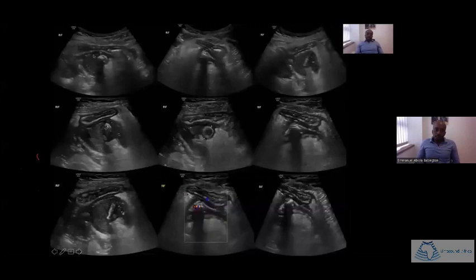So in the right iliac fossa, you can see the collection there. This is the base of the appendix. You can see the bright structure there, which was likely representing the appendicolith, then you see the posterior acoustic shadow there. And here you can see a normal bowel loop, and then the collection just here. Here you can see the collection beside the appendicolith. Transverse view of the appendix.